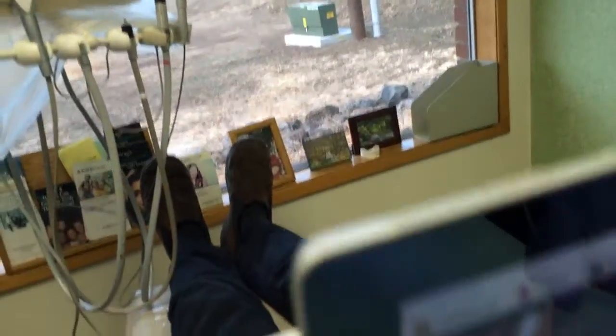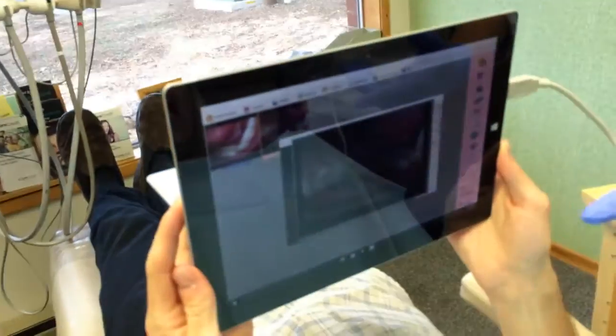You can open up, and there's that picture right there. Let's zoom out a little bit, Sam, so that way you can see it. Just back up, there we go. That's the picture we just took right there. You can see different things.